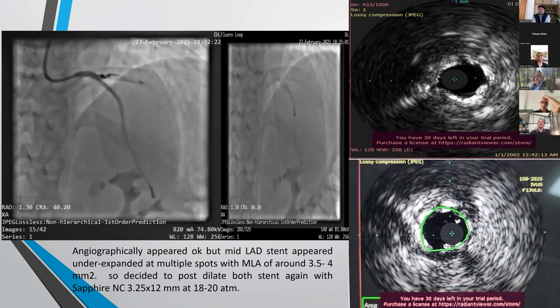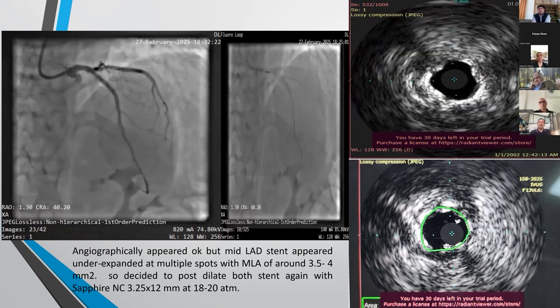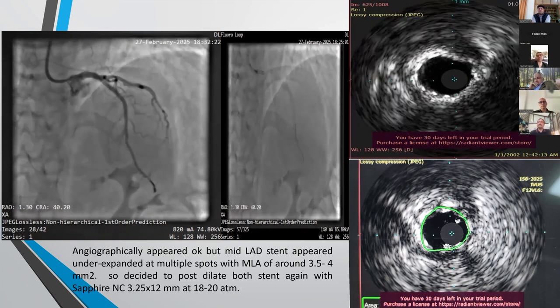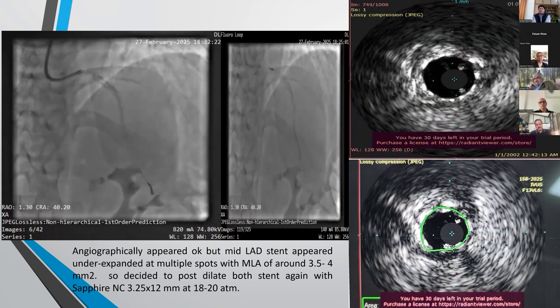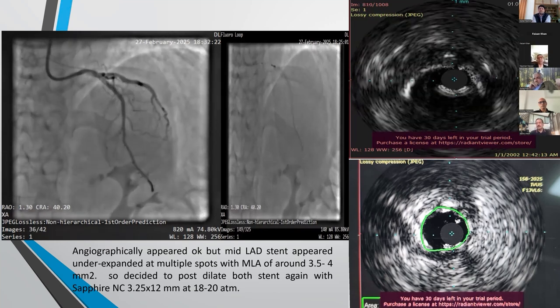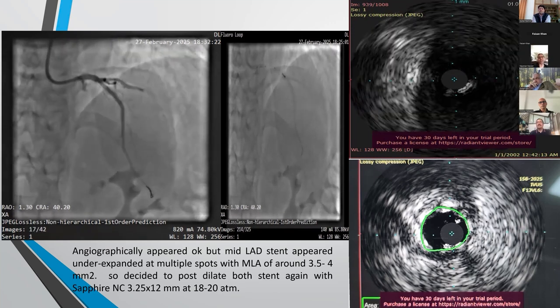If you haven't used it for months, nobody would know where the machine is, where to hook it up, how to switch it on, and how to put in the name and all that stuff. So your staff should be very proficient to help you during the case, because your focus is on the case and you don't want to be wasting time getting the machine started yourself.